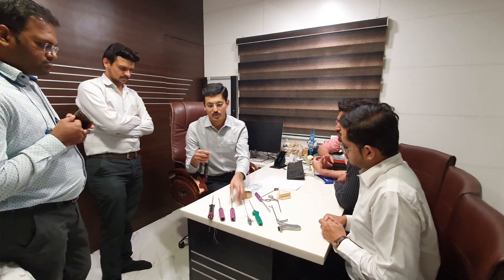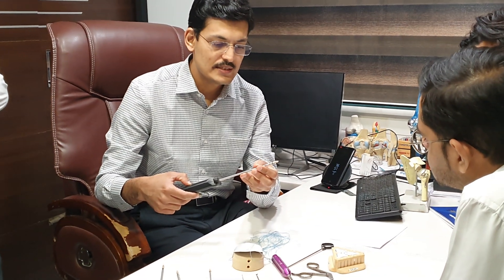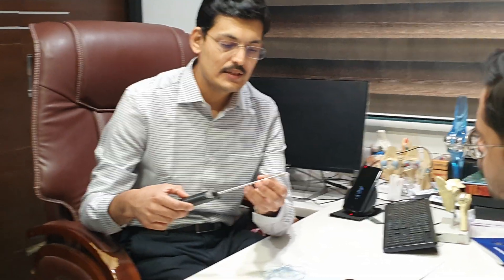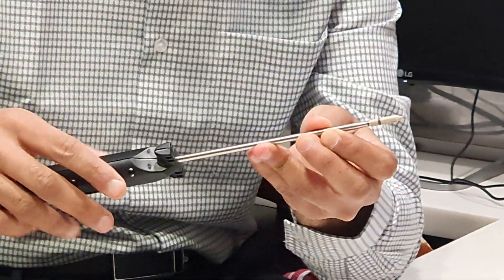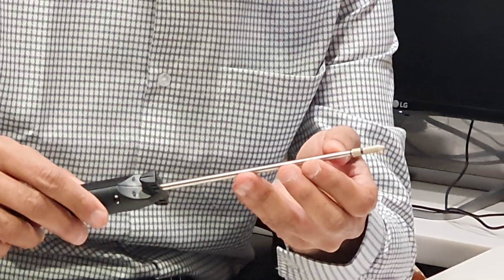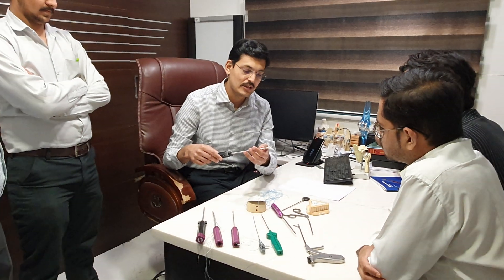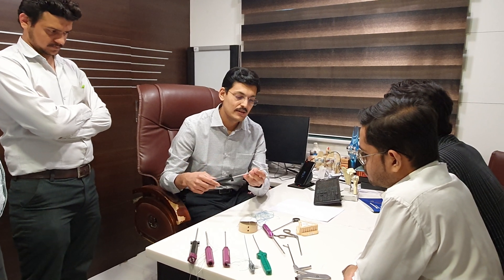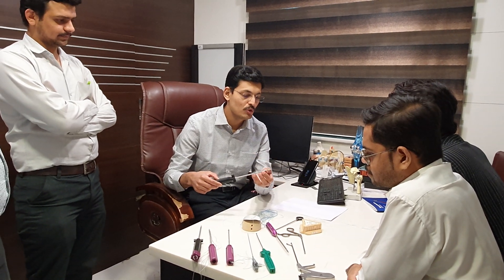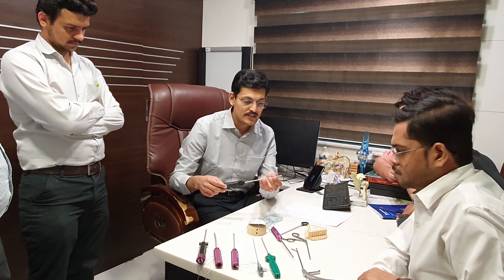This anchor is called the Quattro lateral row anchor. It is also a PEEK material anchor and is unique in that it has the largest capacity to incorporate different threads — approximately six to seven threads, and can accommodate up to eight threads. It can also easily accommodate four to six tape sutures, which is much more than other lateral row anchors that typically take up to two or four suture limbs.